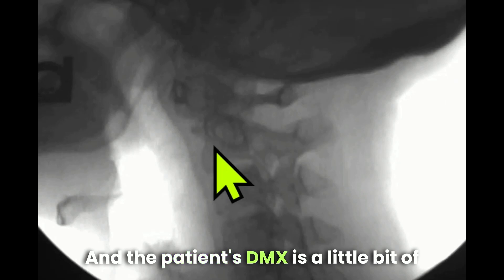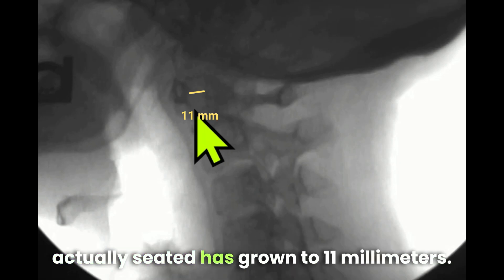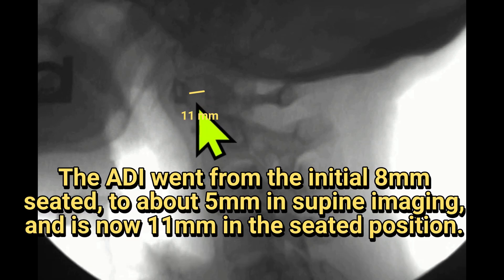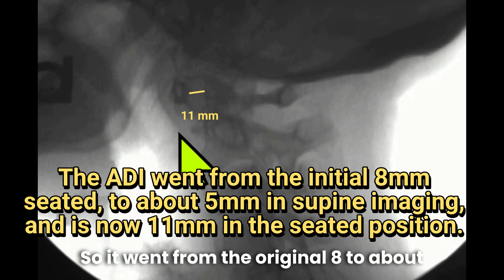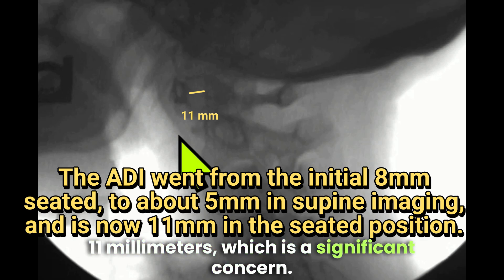The patient's DMX is a bit of a surprise, because now the atlantodental interspace when she's actually seated has grown to 11 millimeters. So it went from the original eight, down to about five in supine imaging, to now around 11 millimeters — which is a significant concern.